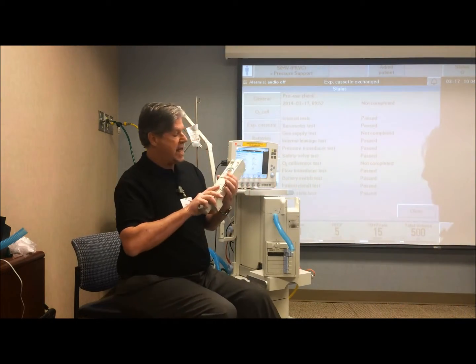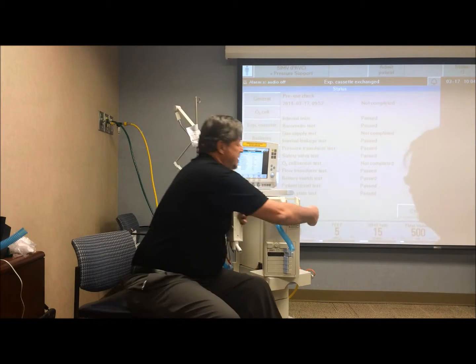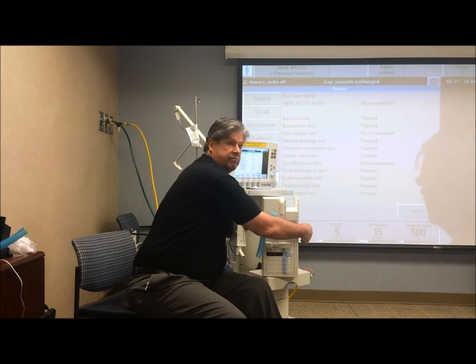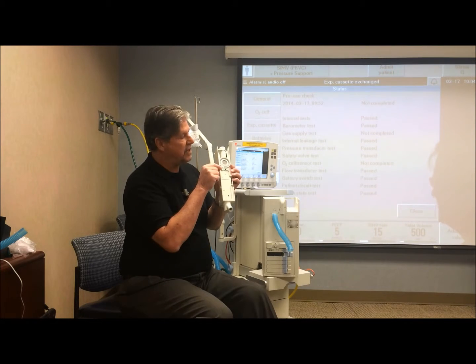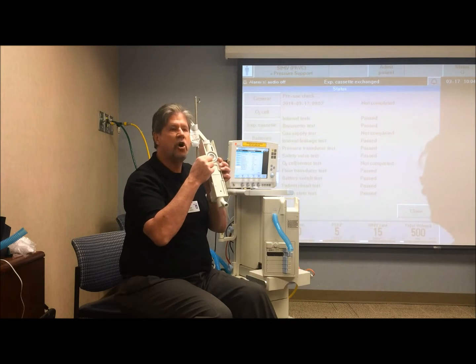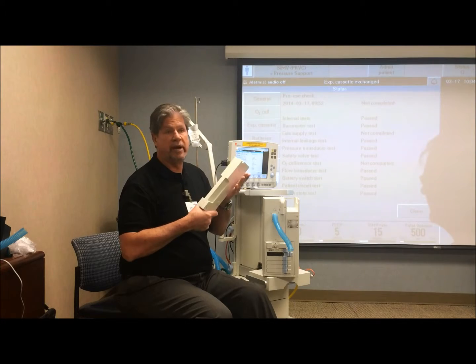When that port mates up with that grommet, underneath this grommet is where the expiratory pressure transducer is. So sometimes during cleaning, if there was a water bubble left in, and as I said, the older style have a much smaller hole, so it's harder for the water to get out. That's why we changed it to a bigger hole.